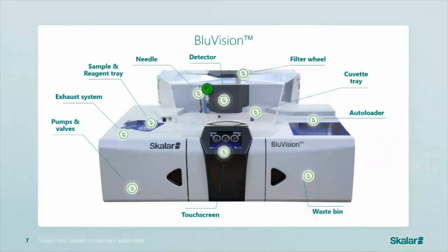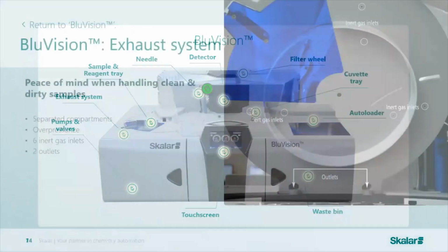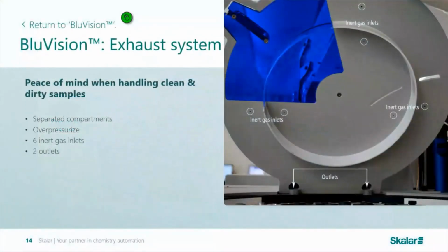Now, just staying with the samples for now. I've mentioned the wide range of samples that need to be analyzed in an environmental lab, but we need to be sure that this is done in an analytically correct way in terms of sample handling, ensuring that there's no effect from one sample to another by contamination, and also that the environment or the location around the analyzer does not contribute in any way to our results. That's particularly in the case of ammonia, which in the right conditions is both very volatile and very soluble.